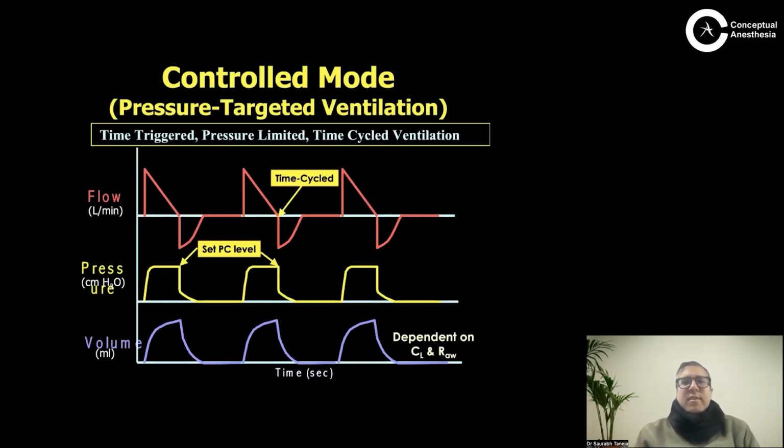So this is the basic graphics of a pressure controlled ventilation. As you can see in pressure controlled ventilation, what is the square waveform? The pressure square waveform. So that is how you recognize that that is the pressure controlled ventilation. How is the flow? Flow is a decelerating pattern. The first waveform, this is a time scalar. The flow has a decelerating waveform and it touches the baseline and then shifts from inspiration to expiration. As I had told you, the flow is the only thing which goes negative also routinely in controlled breaths.